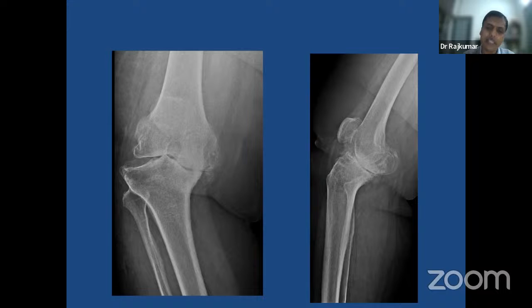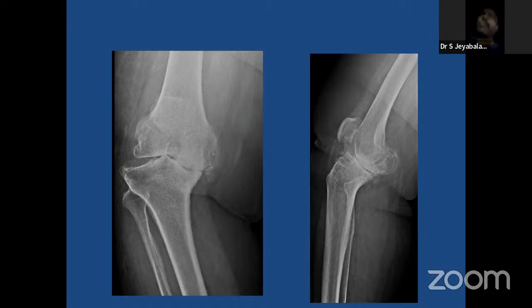Whether the knee is stiff or not, make it a routine, because 60% of the time you will see how much opening is happening. So you will not need much release at all, because the subluxation is happening due to the bone loss and not due to the contracture. So the first thing is try to take a stress view. Many a times it may not help, but a lot of times it will help.